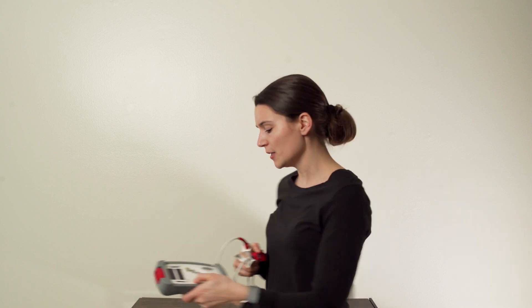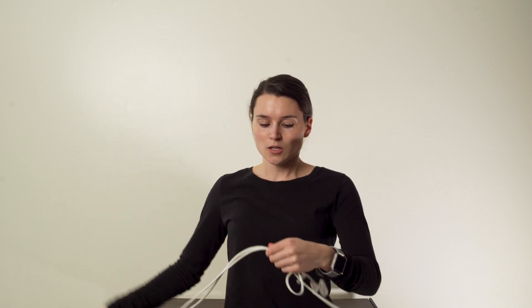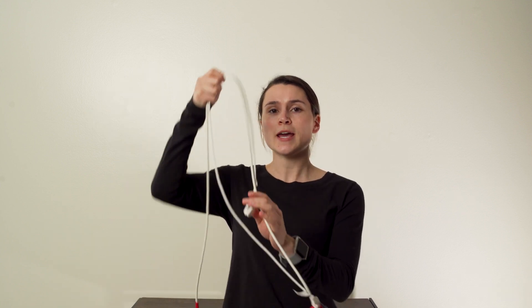For storage, remove the cord from the pulse oximeter. Detach the two cords from one another. Store them by hanging them on a hook on the wall or in a cabinet.